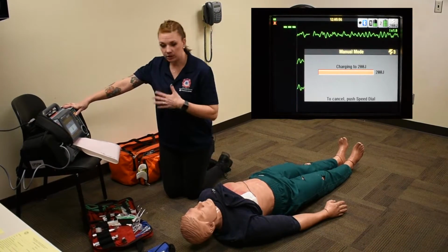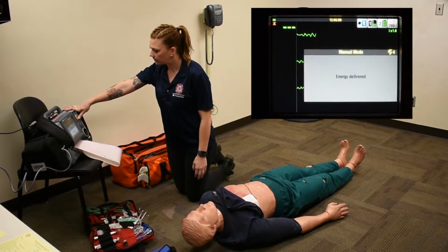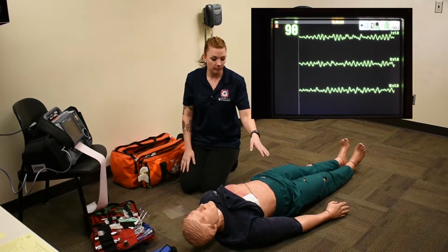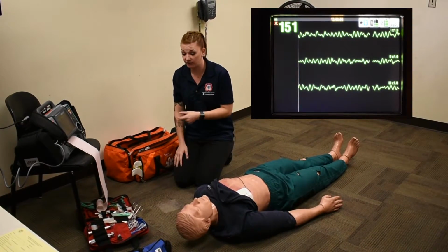Okay, I'm clear, you're clear, everyone is clear. Going to go ahead and shock. All right, going to go ahead and continue CPR. At this time, I will give my milligram of epinephrine, 1 to 10,000. I can do that every 3 to 5 minutes.